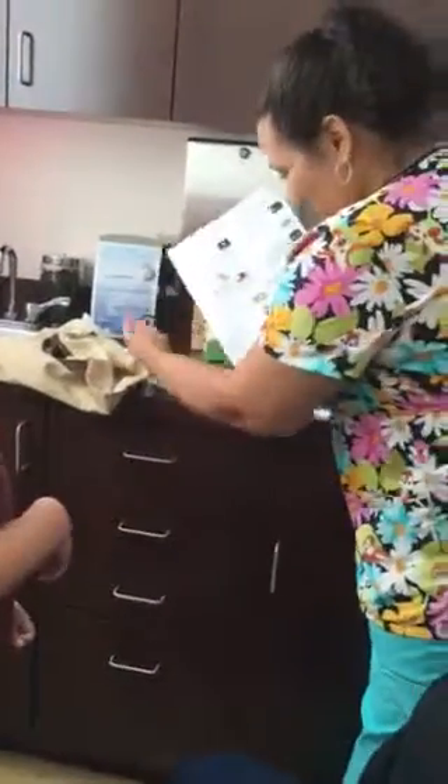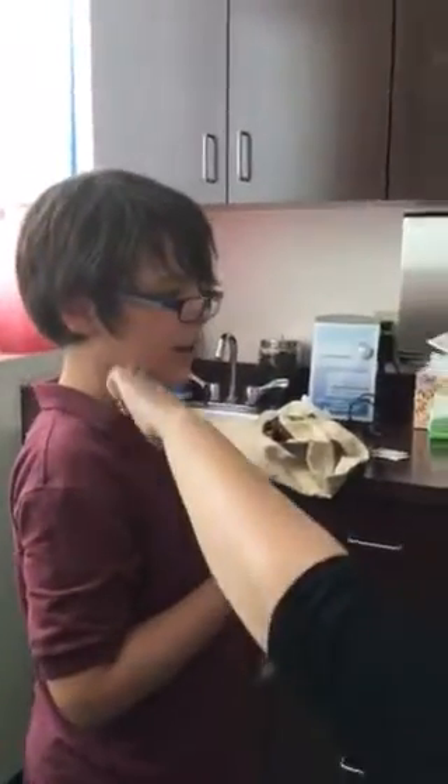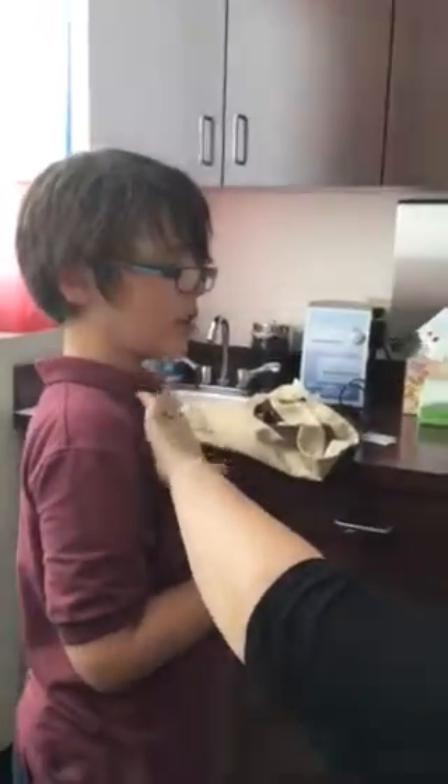So next time you know — seven days. Now it's in, and then we have to write with the sharpie next time here so we know. Maybe we can make a tattoo? No, I don't want sharpie every time I take off my shirt. So look, we already did all this — we unglued it, we stuck it, we did the little clip. We did it right — starting your sensor.